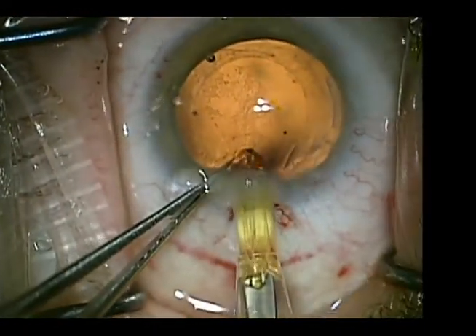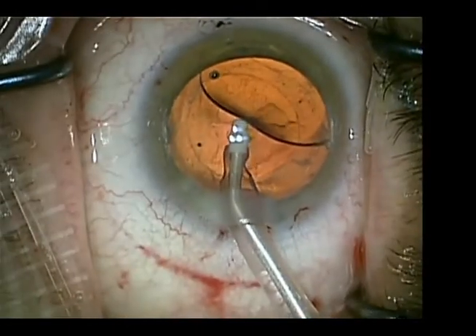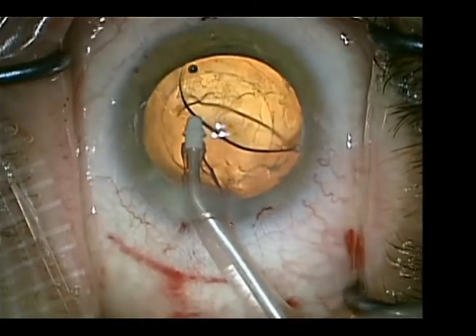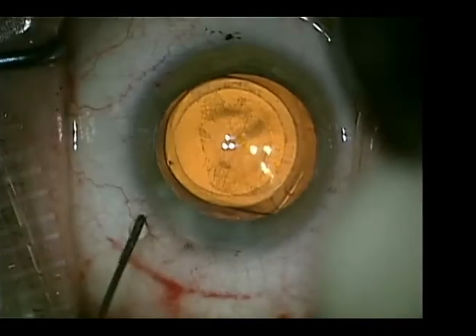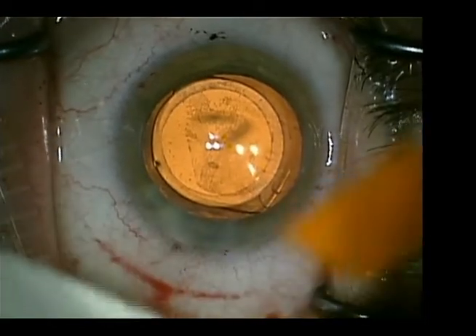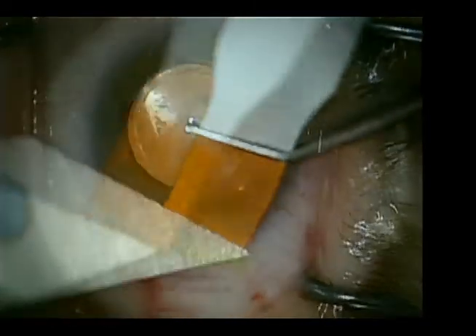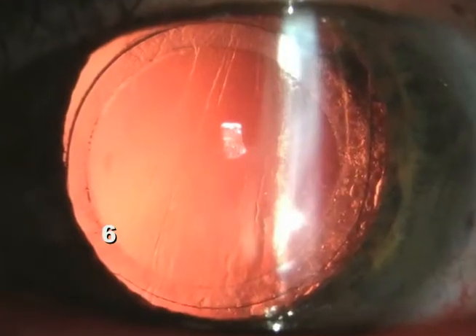Following this, an appropriately powered single-piece acrylic monofocal lens is then implanted into the capsule bag, and the viscoagent is removed from above and below the lens, intraocular pressure set at physiologic levels, and the incision then tested with fluorescent dye and the Seidel test.